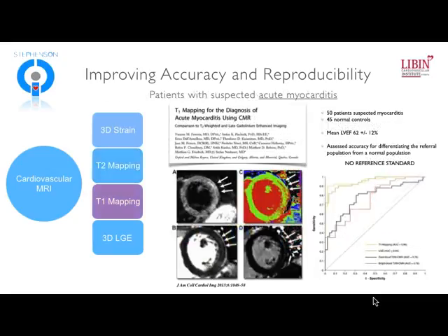Now, T1 mapping has certainly had a greater wealth of study and publications, maybe not in this particular clinical arena, but there are a couple of studies worth mentioning that have really focused on native T1 mapping, so non-contrast T1 mapping for the detection of acute myocarditis. This was work published out of the Oxford group, and it was a study in 50 patients suspected of myocarditis in 45 normal controls. And you can see by the EF that these are mostly patients not presenting with heart failure, but usually presenting with chest pain syndromes.